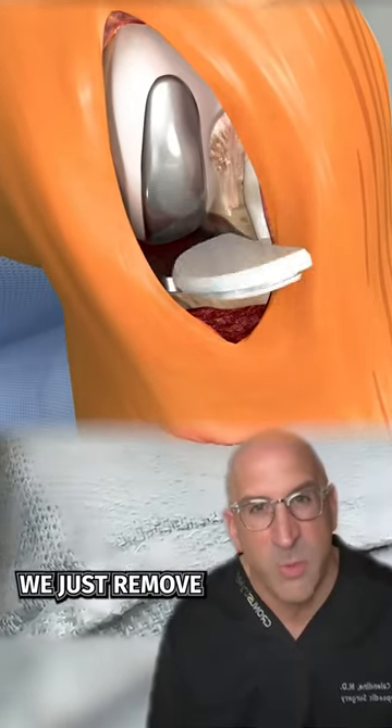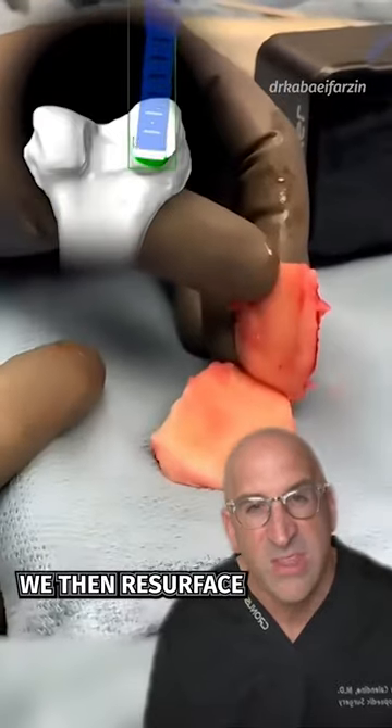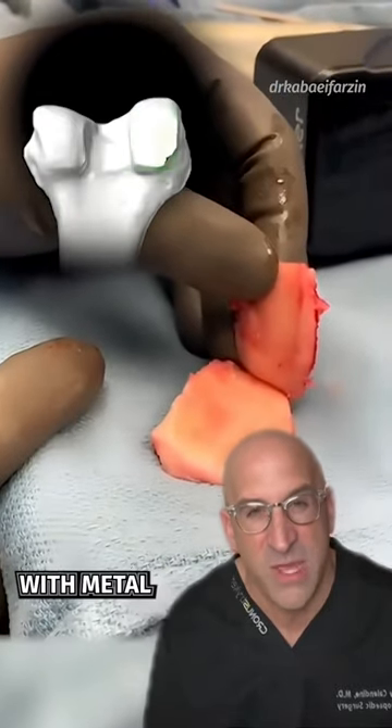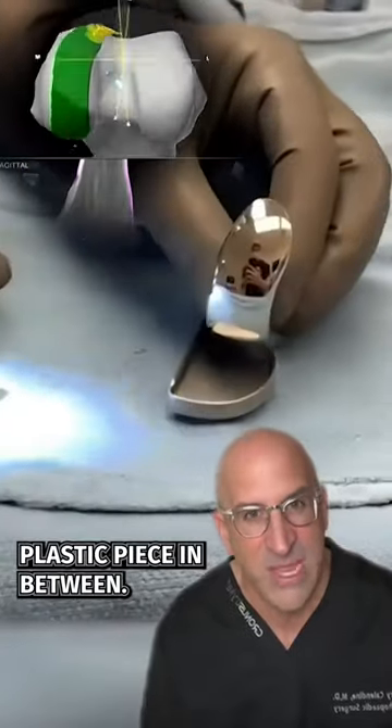During partial knee replacement, we just remove a sliver of bone from the tibia and a sliver of bone from the femur. We then resurface the ends of the bone with metal. On the femoral side we use cobalt chrome, on the tibia we use titanium, and then we put a plastic piece in between.